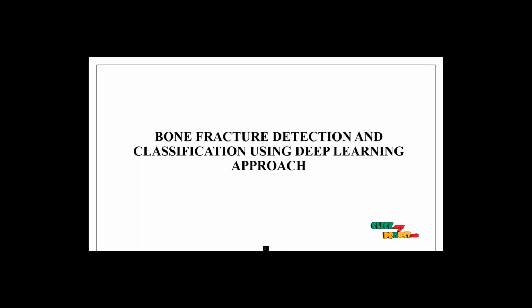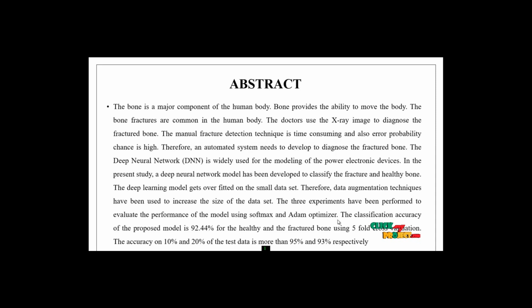Our project title is Bone Fracture Detection and Classification using Deep Learning Approach. Our project abstract is this: bone is a major component of the human body. Bone provides the ability to move the body, so bone fractures are common in the human body. The doctor uses X-ray images for diagnosis of bone fractures.